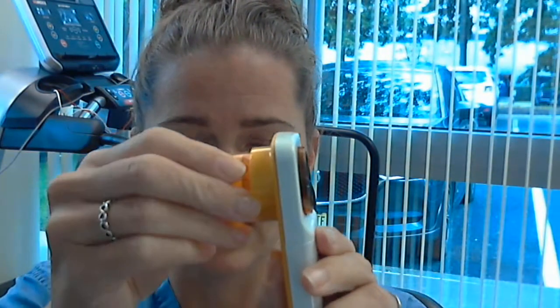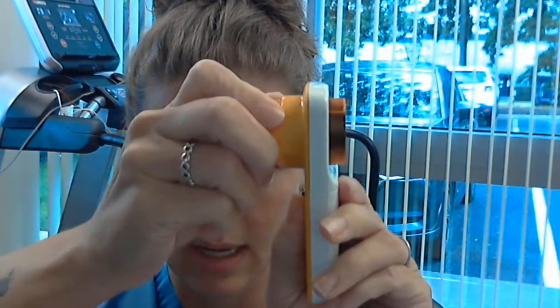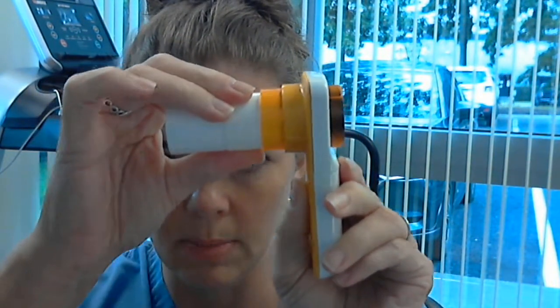Then you just put your spirometer back together. You insert it all the way — see how it clicks? — and then you turn it until it doesn't turn anymore. You take your mouthpiece, put your mouthpiece back in, and it is all ready to go.